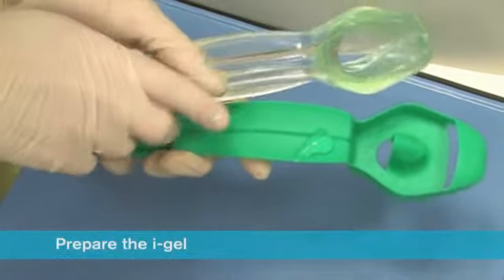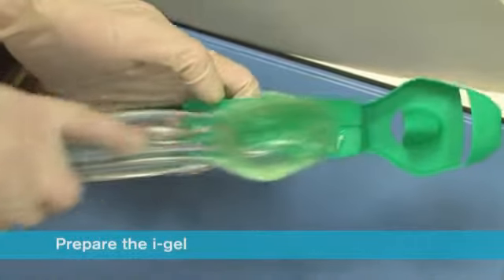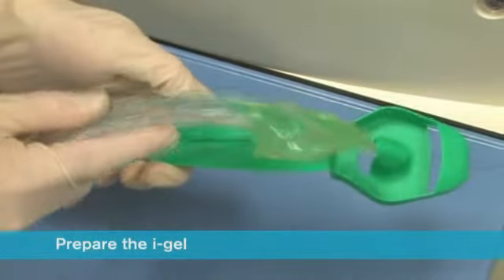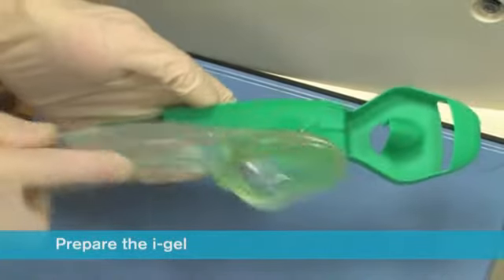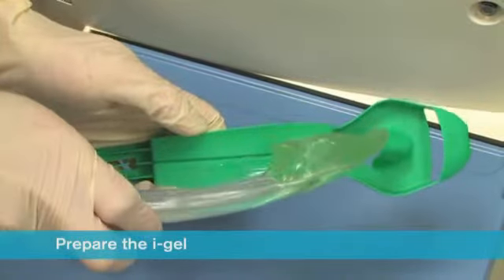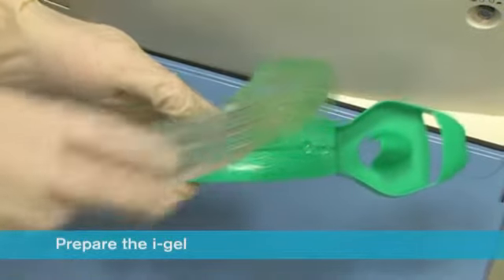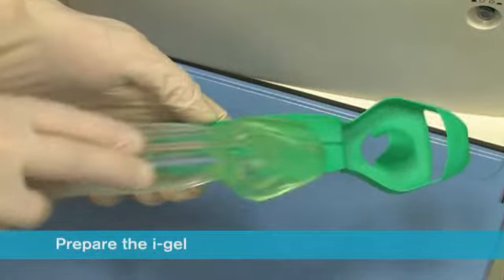Grasp the iGel with the opposite free hand along the integral bite block and lubricate the back, sides, and front of the cuff with a thin layer of lubricant. This process may be repeated if lubrication is not adequate.